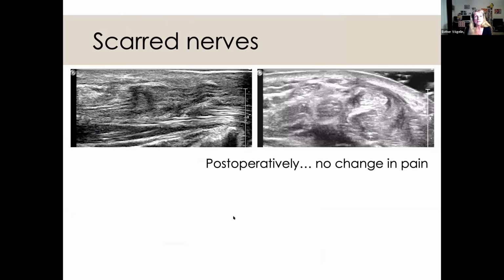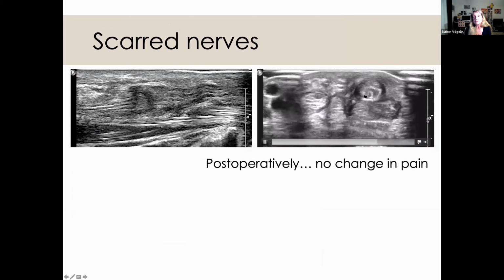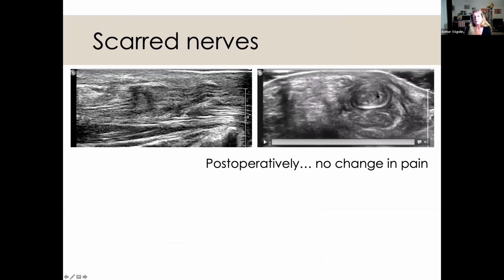Afterwards, we actually checked sonographically 5 months later the course of the nerve, and you see here the nice fibers. Then there is a bump again, and you can follow the nerve fibers distally. When you look at the cross-sectional area, you see here the median nerve, the salami slice, and when you look what this salami slice is doing, you see that there is not a normal structure here in between.